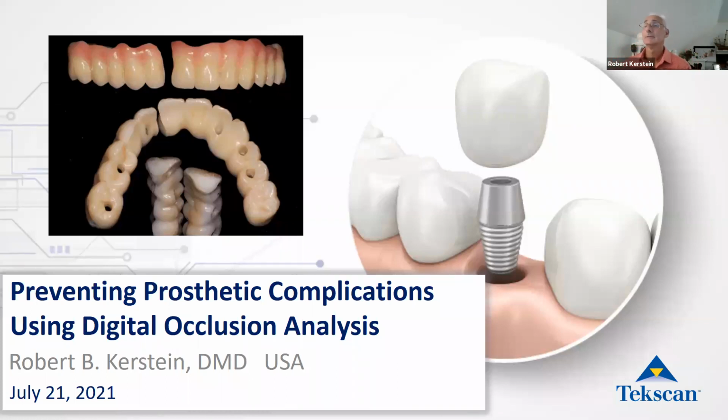And I can speak to this because in my 37 years of using the T-scan technology, I was sought out by patients who had dentistry installed and struggled to adapt. And the interesting thing about that was that it wasn't always full mouth rehabilitation. It was 3 fillings, 2 crowns, a tooth was extracted, or they finished orthodontics and they were developing symptoms very soon after their occlusion had changed.